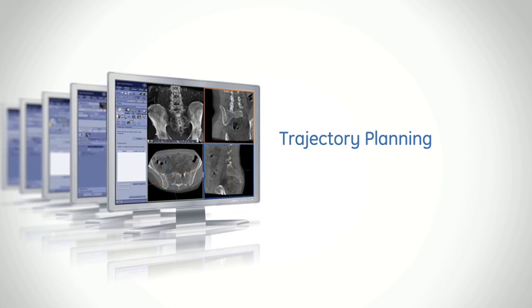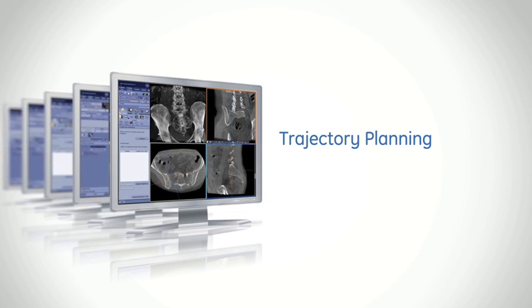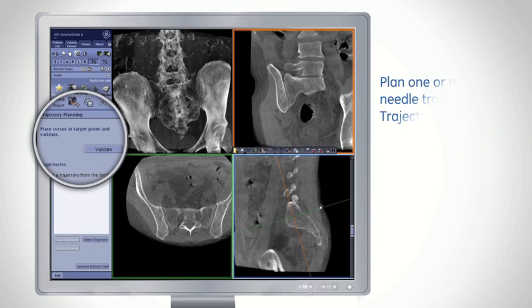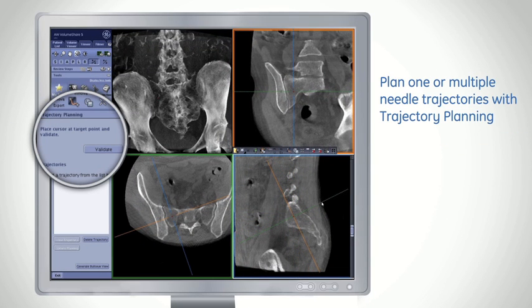With trajectory planning, you can easily define one or multiple trajectories on cross-sections from your 3D acquisition.